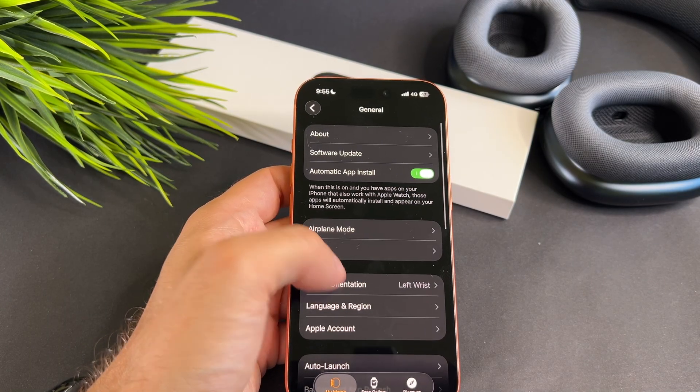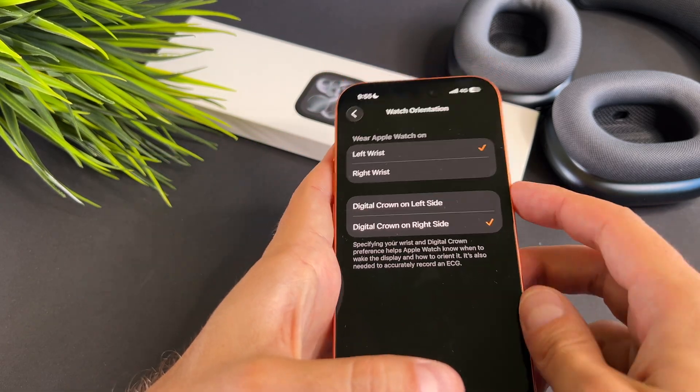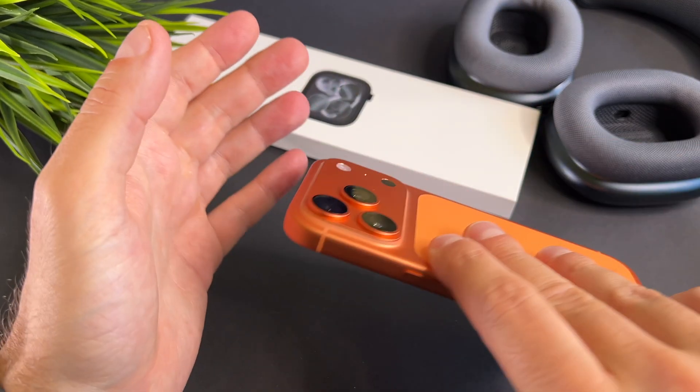Please check that the settings here match how you are actually using your watch. As this message says, the digital crown orientation is needed to accurately record an ECG.